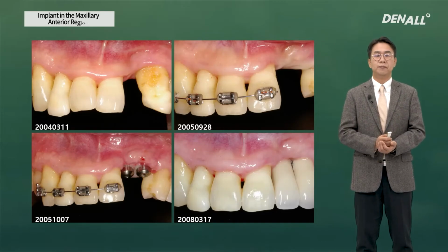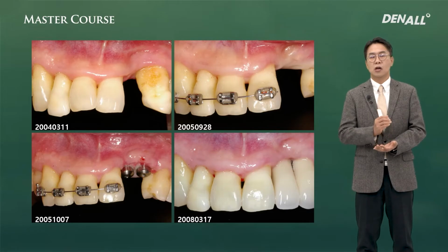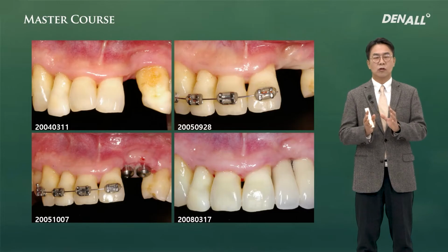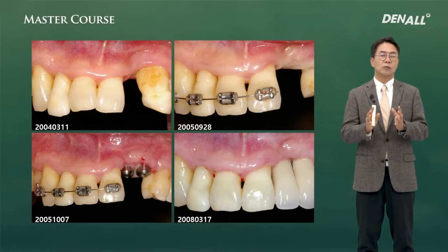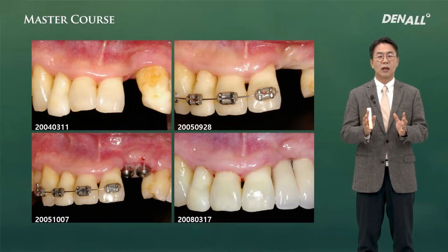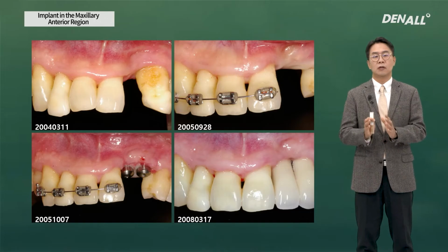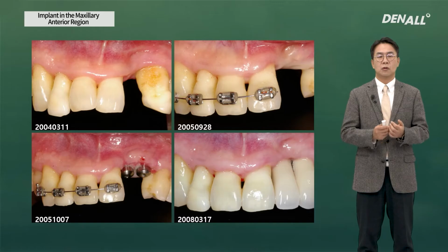If you look at this case, a periodontal disease is quite progressed and it is treated to complete the prosthesis. The gingival line and the contour compared to before are not really bad, but if you compare them, we may think, was it the best treatment that they could do? Of course, it was the best treatment we could provide. However, if you repeat the surgery, side effects can occur.